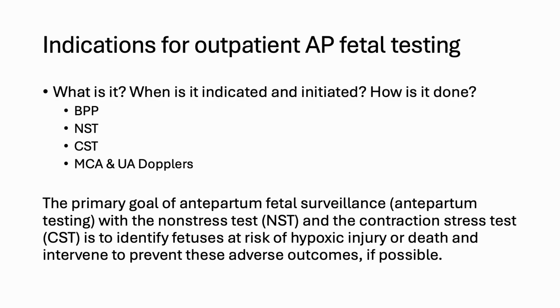So let's start with indications for outpatient antepartum fetal testing. We call this antepartum fetal surveillance, we may call it APT, antepartum testing, but what is it and when is it indicated? And when is it initiated and how is it done? We need to know all of these things as you begin intrapartum, antepartum, even your residency courses.